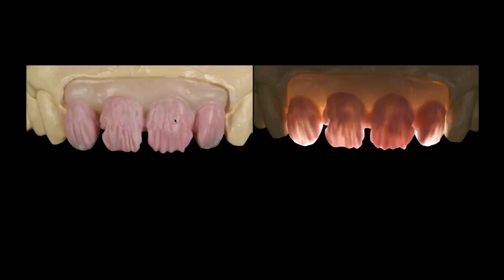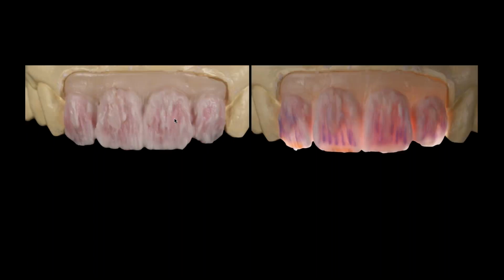So we'll build up our ceramics, and usually in courses, this course was in London a year or two ago, we always take one of the participants in the course and use them as the patient. In this case, I took a picture of a young technician in London. Her name was Rachel, a great girl. And we used her as the example of how to follow her natural teeth. We did all this in predominantly one bake, mostly because I ramble on too much, and we run out of building time a lot in these 2-day courses.